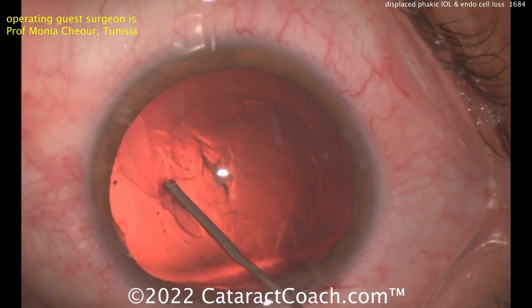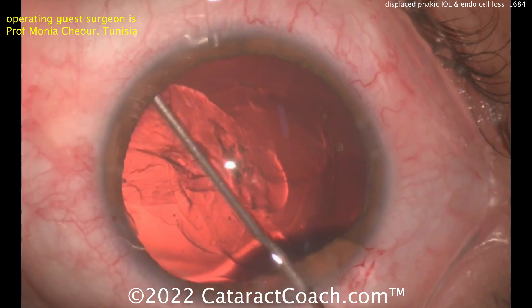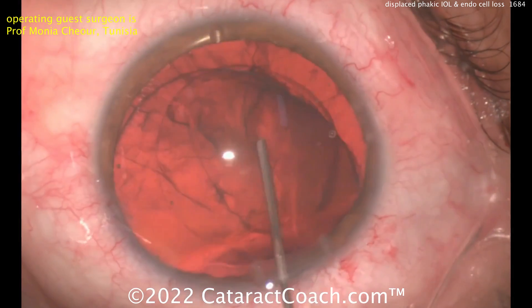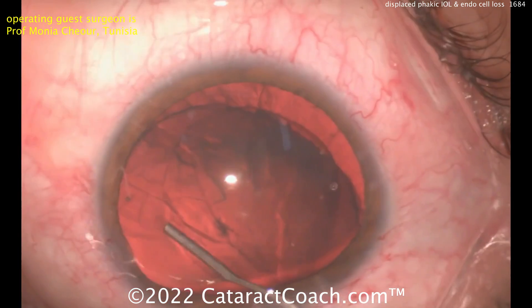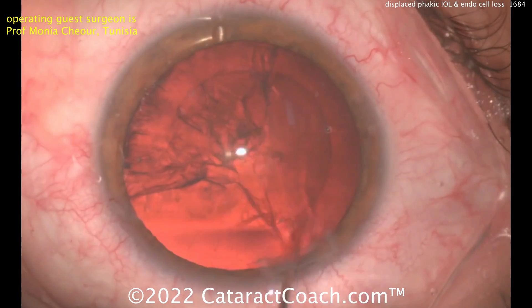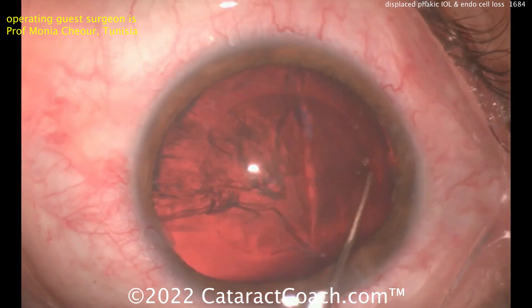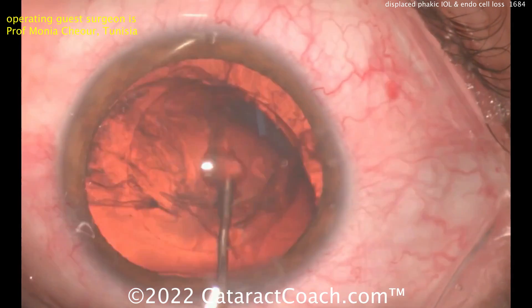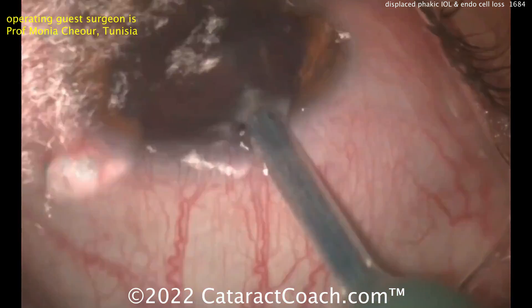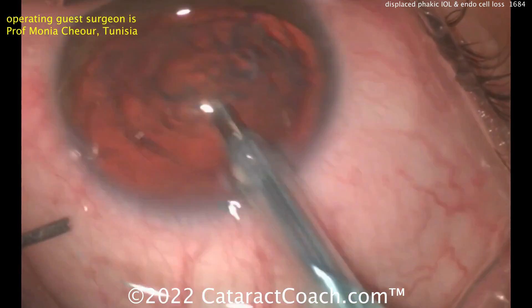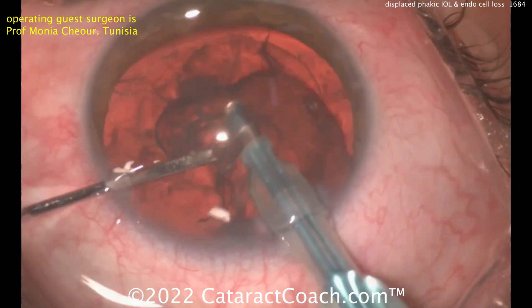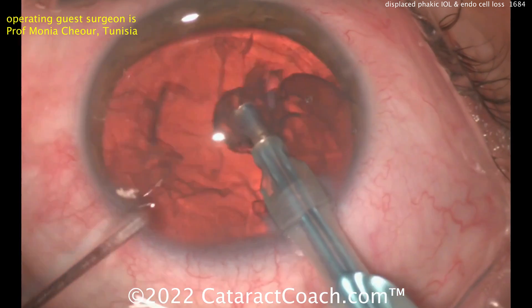If you put a lens in here, what are our choices? You could put a monofocal lens, in which case you'd probably be best off aiming for close to plano — maybe just a bare pinch of myopia. You can see how soft this lens is — it can just be aspirated out; you don't even need the phaco probe, you can do the whole thing with the I/A probe. I like the idea of getting it out of the capsular bag and away from the posterior capsule. No ultrasound energy needed — look how fast it goes down, it's so soft.